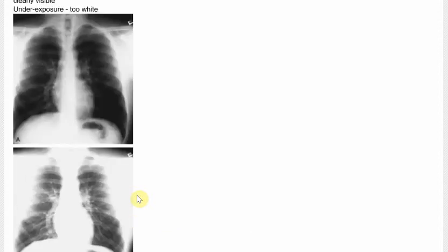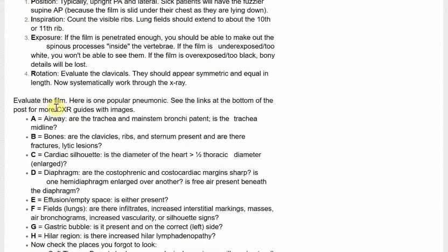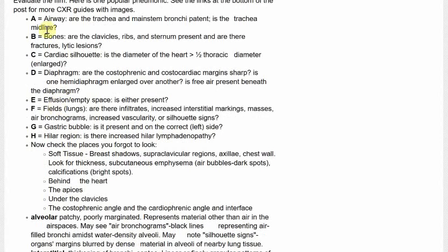Different people have different ways of interpreting chest X-rays. We went through the technicalities of it: position, inspiration, exposure, rotation — I'll go through that at the end. You can use a checklist system: A for airways, B for bones, C for the cardiac silhouette, D for diaphragm, E for effusions, F for lung fields, G for gastric bubble, H for hilar region. Some people find that checklist system useful — you can pause the video or visit my website to read more about it. Credits to radiopaedia.org.